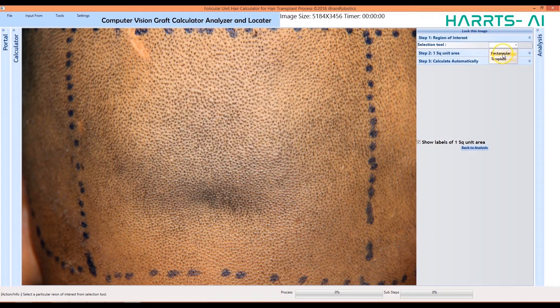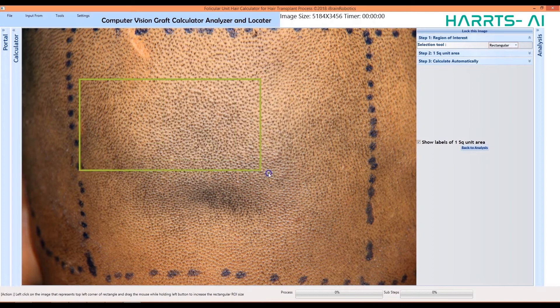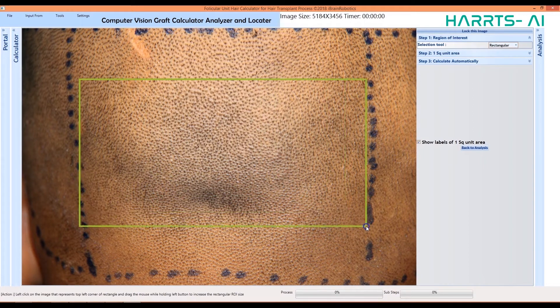For using the rectangular tool, simply click on the upper left corner of your area of interest, and drag the cursor downwards, till you select the entire area of interest.